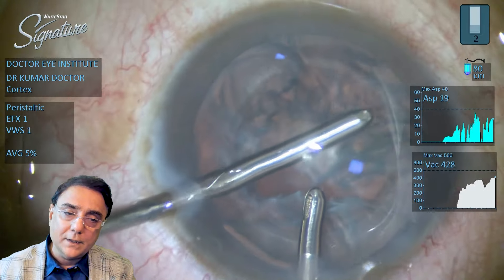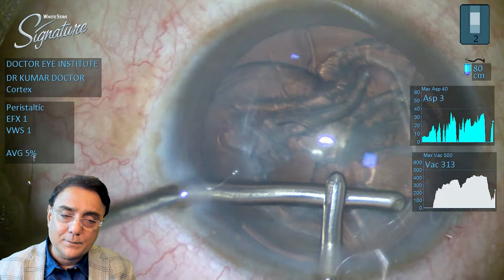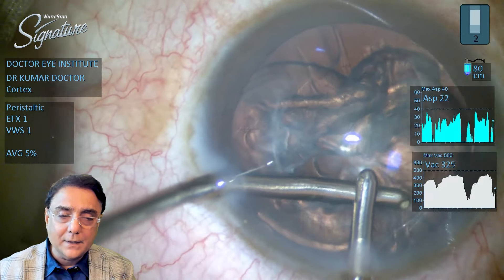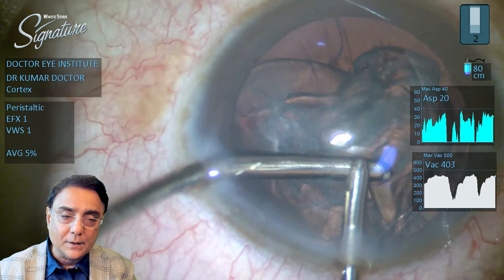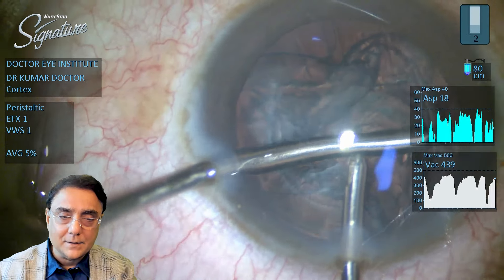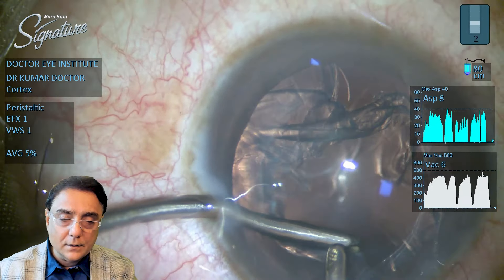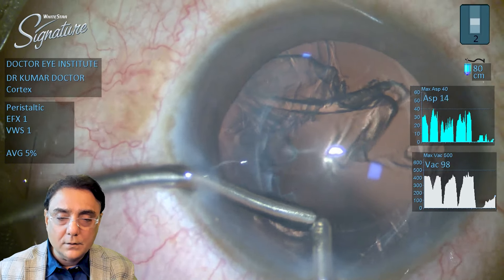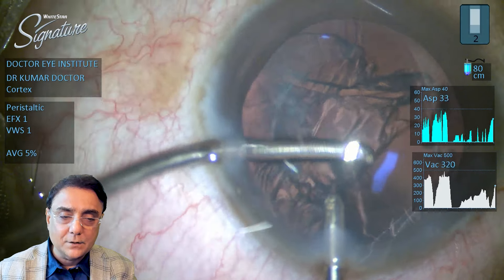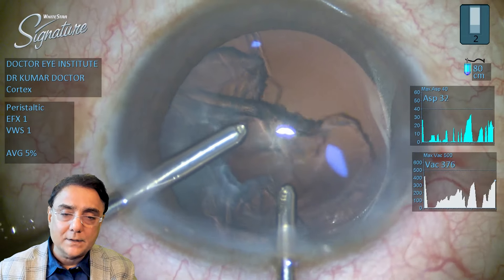Go underneath the CCC and hold on to the cortex. Once you hold on to the cortex, aspirate it and bring it to the center, facing the aspirating port towards you, then increase the vacuum. The maximum vacuum set here is 500. When the vacuum goes up, all the cortical matter gets aspirated. The safety factor here is: occlude, aspirate, and increase the vacuum when the aspirating port is facing you. This will prevent all complications which can happen during the step of irrigation aspiration.